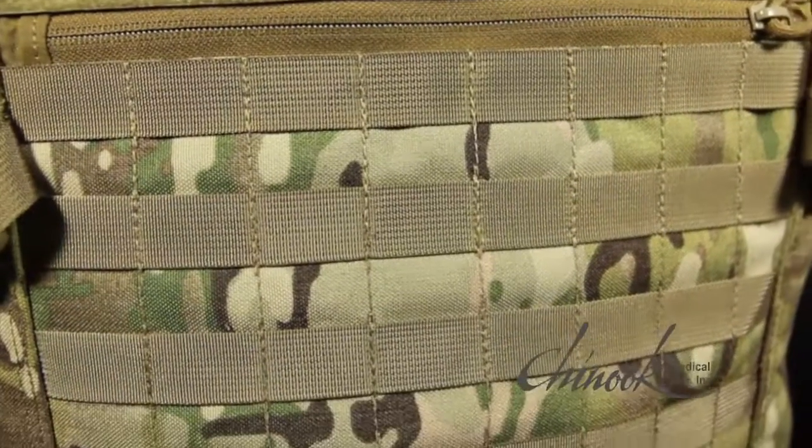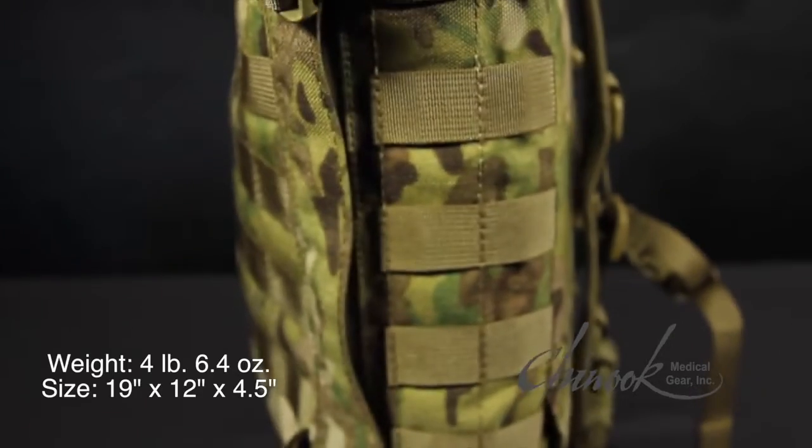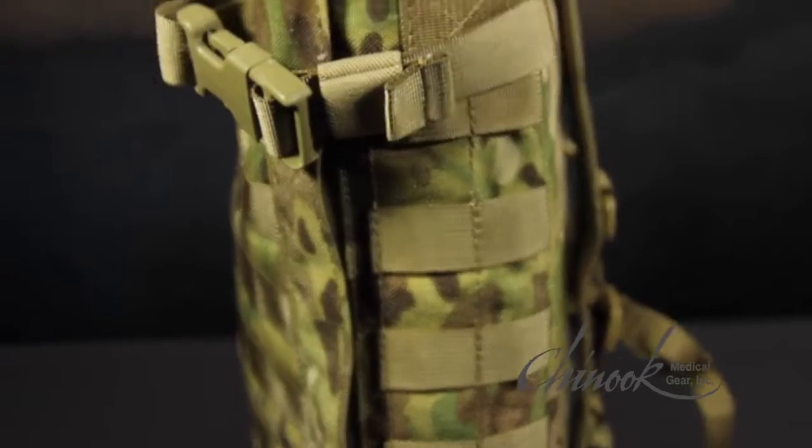After receiving extensive input from the military special operations community, Chinook designed a tactical medical pack for medical operators known as the TMK-MO. This bag satisfies the growing demand for a low profile medical backpack. The MoBag is lightweight and provides medical operators with the perfect combination of carrying capacity and streamlined design.